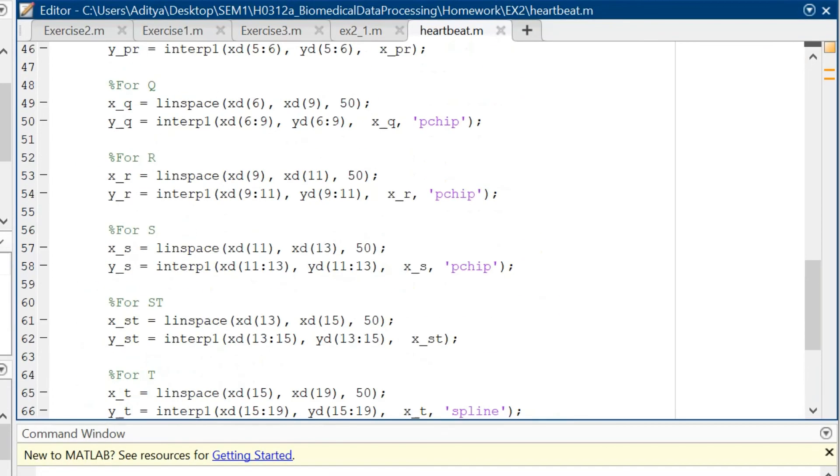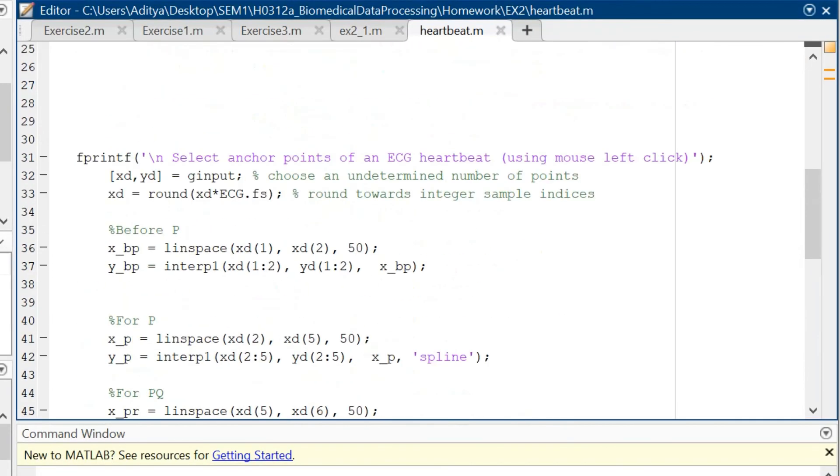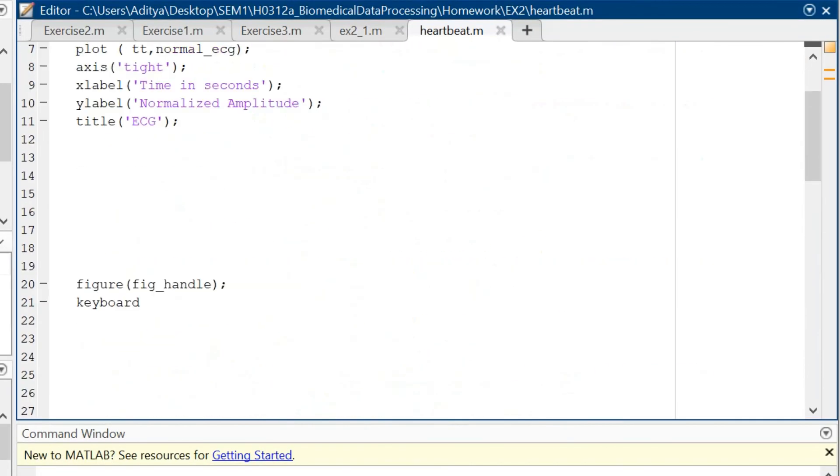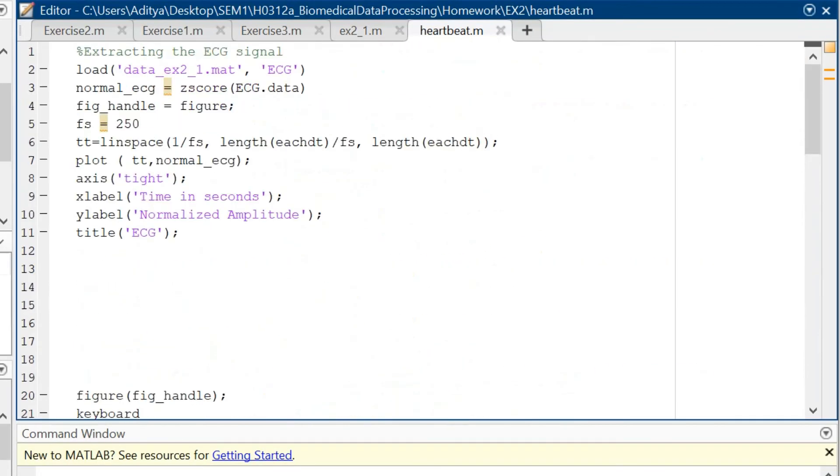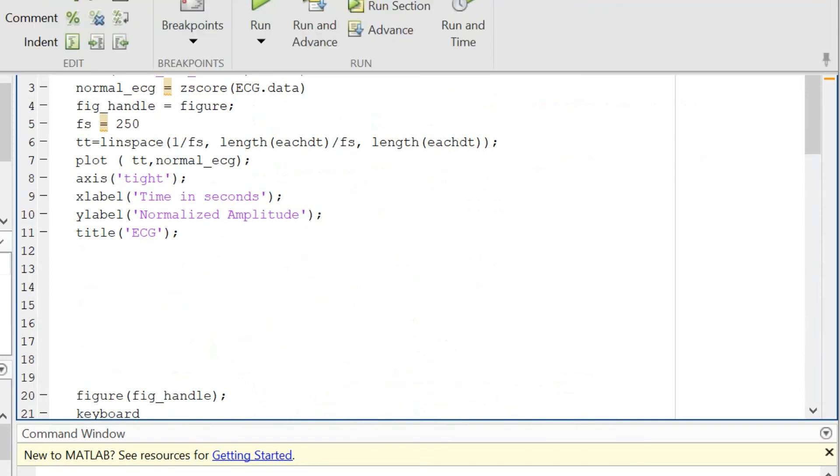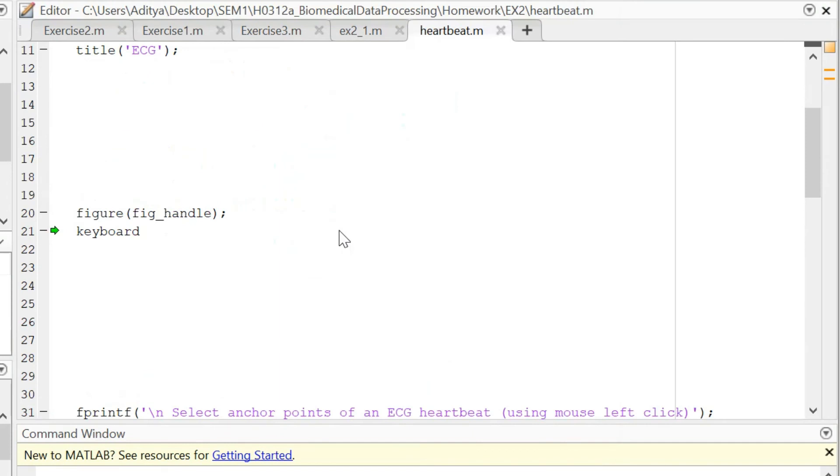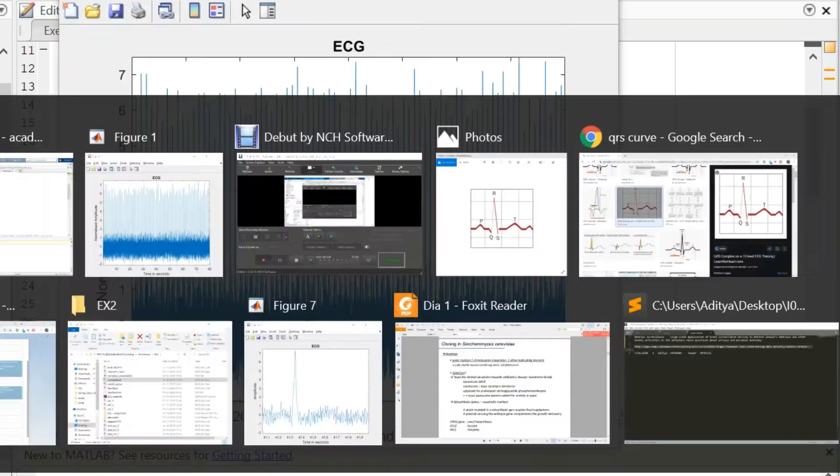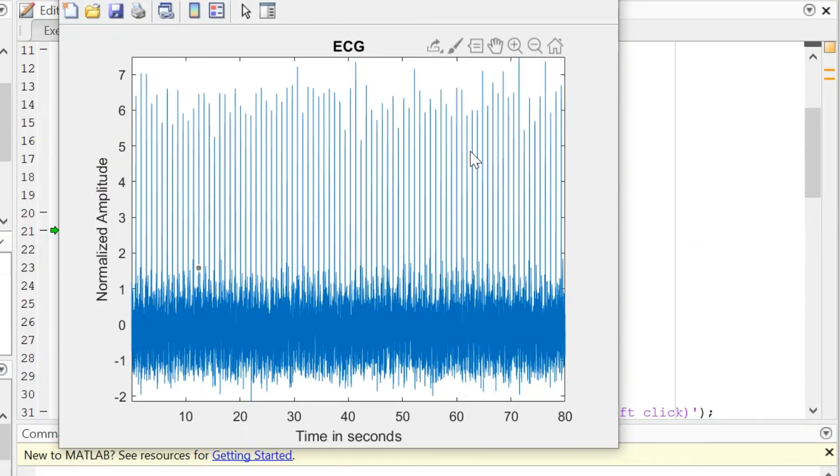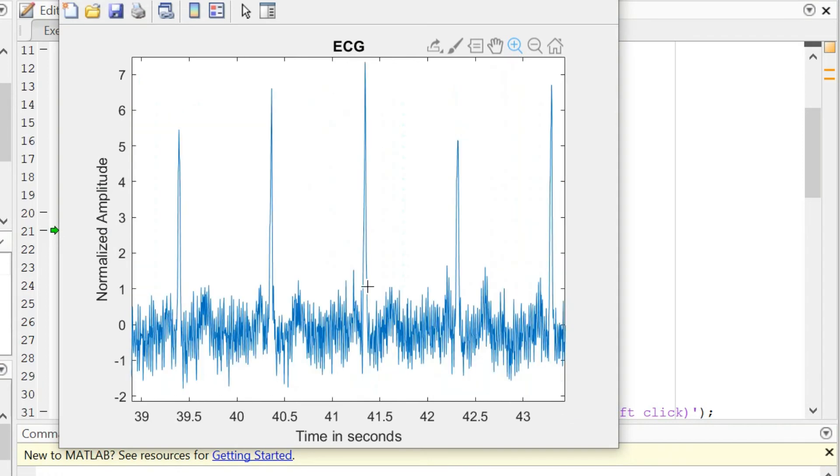Now let's see this code in function so that we are clear as to how this should work. First of all we encounter the keyboard signal and we have to select the ECG point at which we will be extracting the PQRST points. This is the ECG. We can maximize and select the exact place that is of our interest.